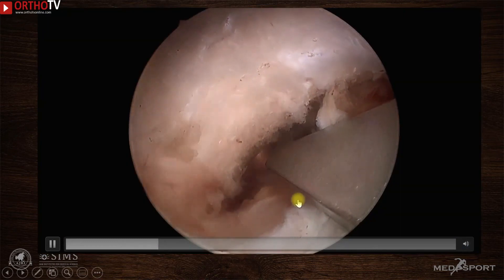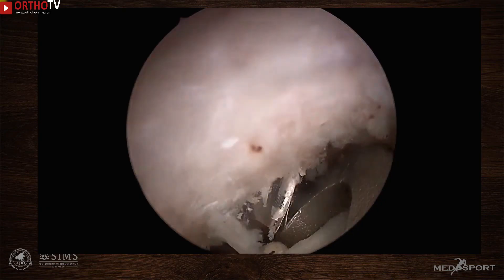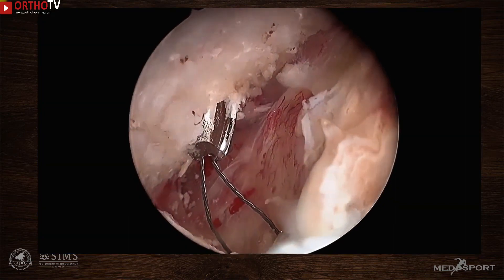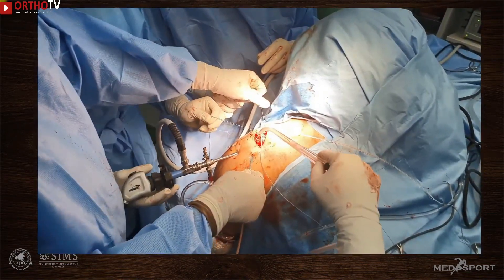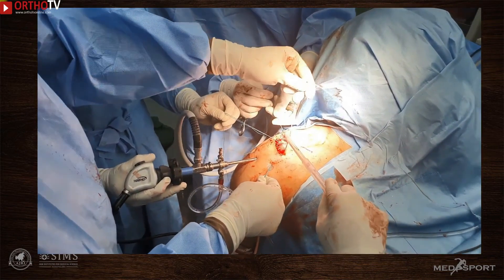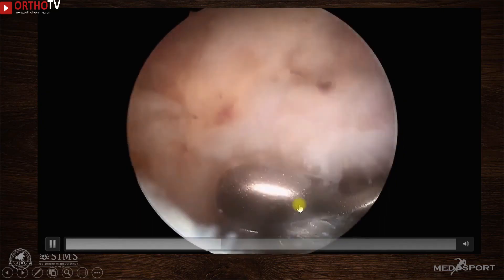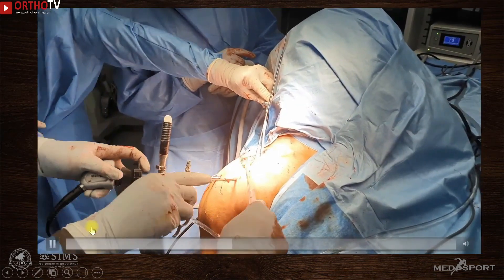The coracoclavicular drilling is performed using a 3 mm cannulated drill bit. The drill bit has a threaded pin which can be removed, and through the cannulation a guide wire is passed, retrieved from under the coracoid, and kept outside the anterior portal. The suture tapes loaded with a dog bone button are then pulled so the button sits under the coracoid, with suture tapes passing through the coracoid and clavicle and exiting on the superior surface of the clavicle. The coracoclavicular fixation may be completed at this stage.